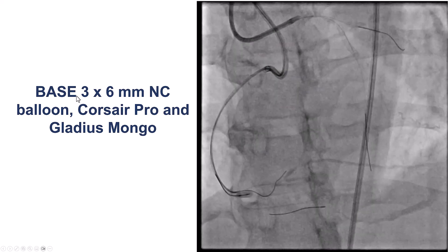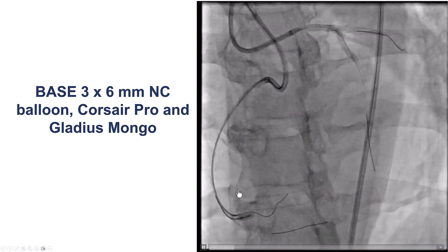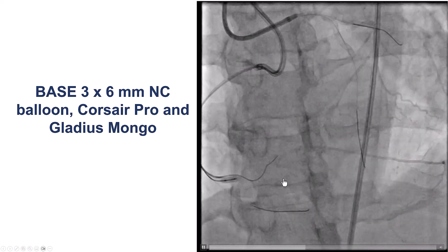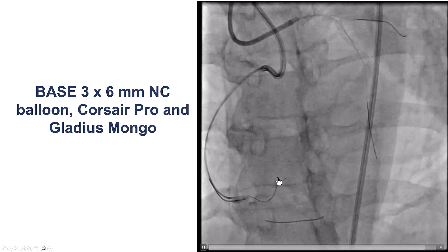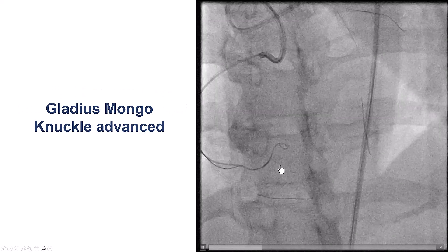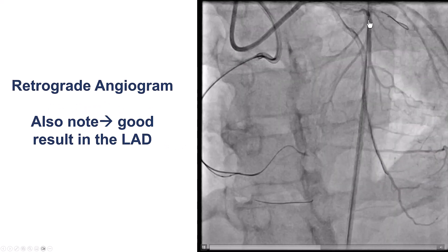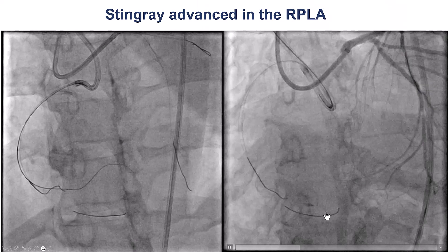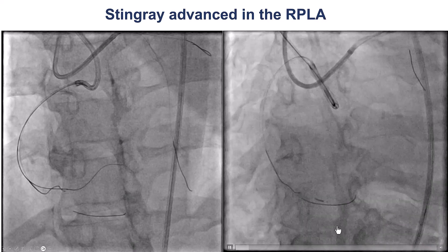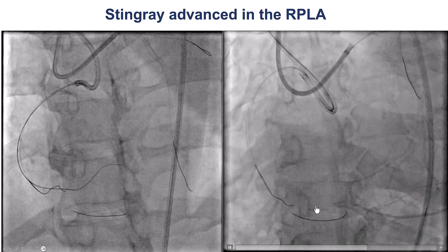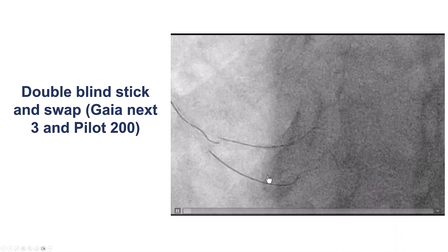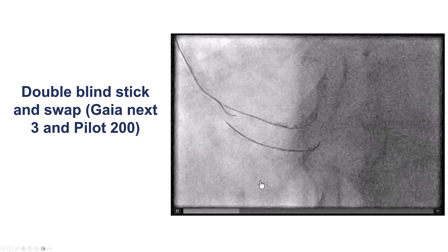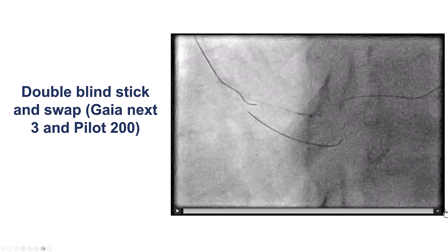We ended up using the BASE technique — balloon-assisted subintimal entry. A 1.5 mm balloon was placed into the posterior lateral, with a microcatheter next to it. Using the Gladius Mongo wire, we penetrated into the extraplaque space and advanced into it, with the wire dancing along the vessel distally — a knuckle placed into the vessel. We delivered a Stingray balloon into the right posterior lateral close to the distal cap, achieving a nice compact balloon position. Using the double-blind stick and swap technique with a Gaia NEXT-2 guide wire, then switching to a PILOT-200, we were able to advance the guide wire into the distal true lumen.